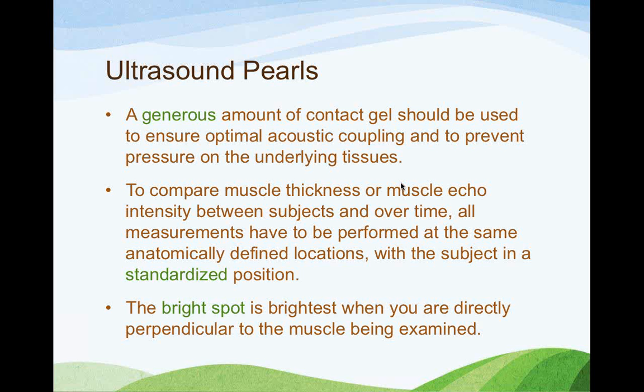We have essentially 85 patients total, I think in the end, once I get all of my unaffected girls in, that we're going to be able to draw from with regards to muscle size, according to a variety of different age groups. So we're going to be able to talk about muscle thickness in certain muscles, muscle area. And we're also going to talk about grayscale and muscle echo intensity that falls in the range of normal for kids that are unaffected by muscle disease, and compare that echo intensity in children with the variety of muscle diseases.